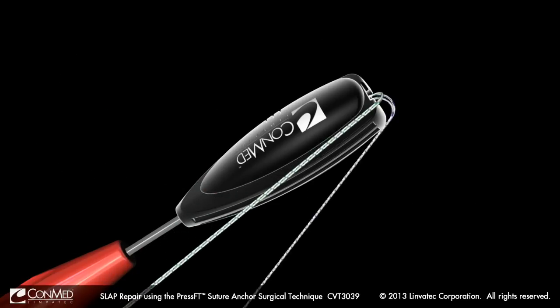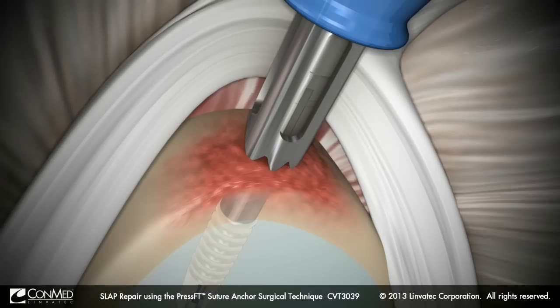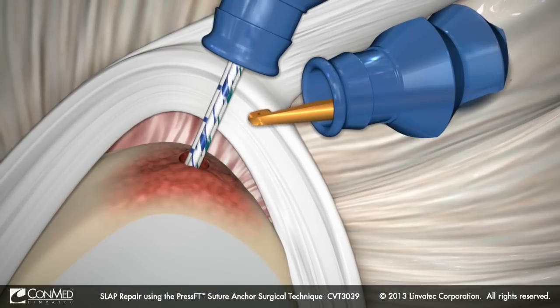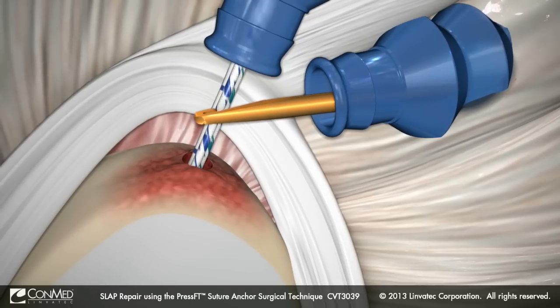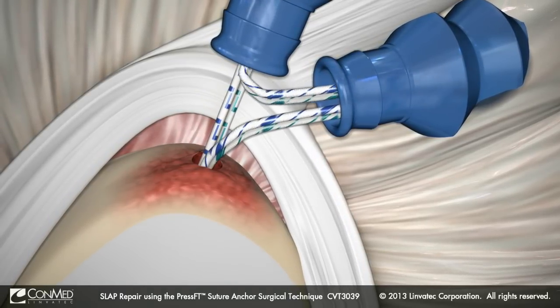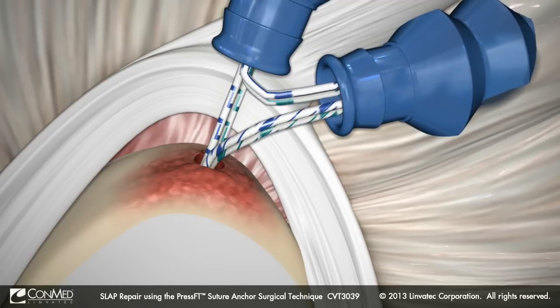Release the suture from the driver cleats and remove the driver and drill guide from the joint. With a crochet hook, retrieve the two sutures nearest the glenoid side of the implant eyelet — one of each suture color — and pull them back into the anterior mid-glenoid cannula.